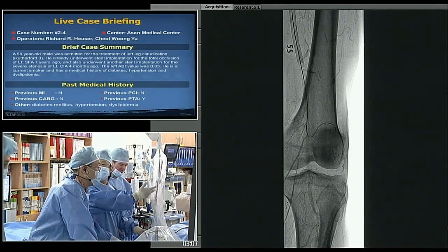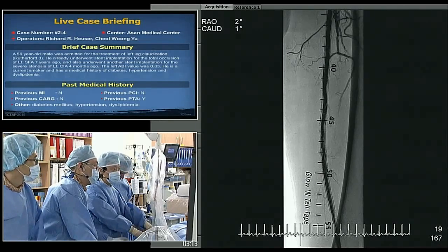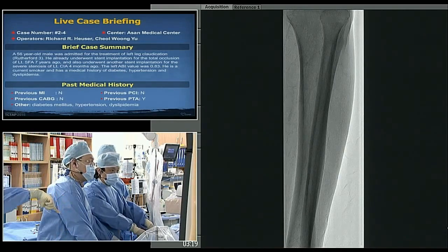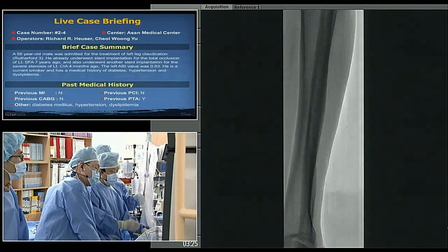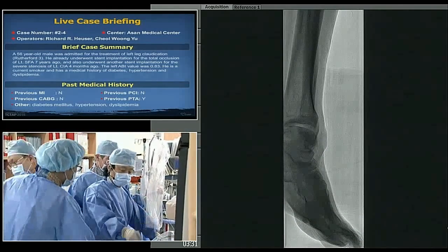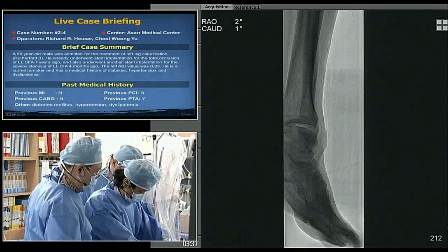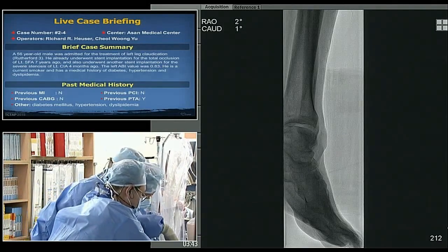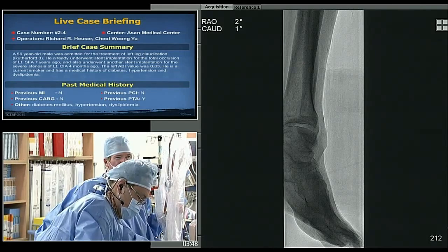Are we going to go further down? Well, I have to say that it's not the biggest SFA I've ever seen. It's not the prettiest picture, but it's what we have here. Yeah, I think it's quite important because the angiogram showed the blood flow in the SFA area seems to be a little bit slower than the previous one. There seems to be some kind of distal embolism.